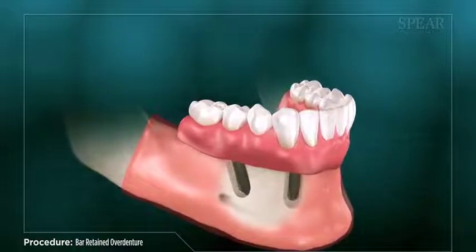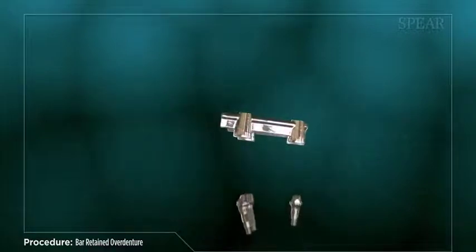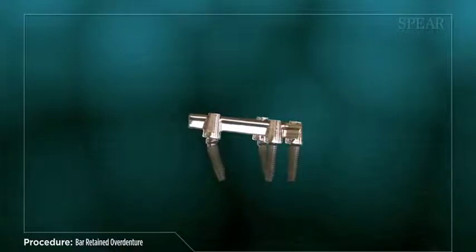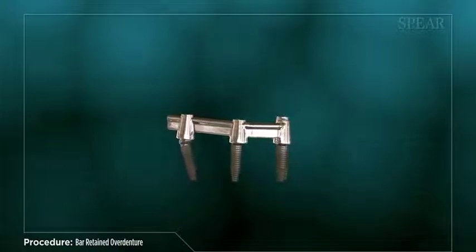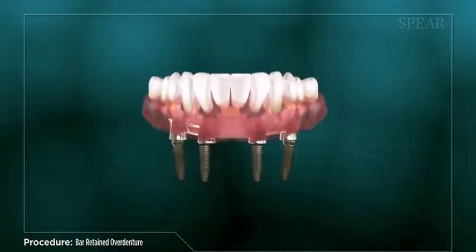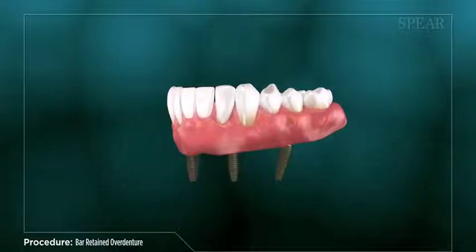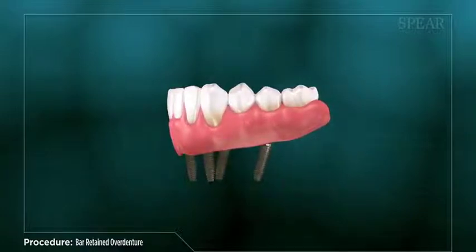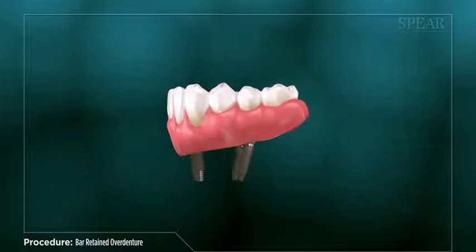It will require multiple appointments for your doctor to place the dental implants and design your overdenture. A bar retained overdenture is a removable prosthesis placed in the mouth containing replacement teeth, mounted in a base made of pink resin, creating an exact fit over your existing gums. It has clips underneath that securely attach to a metal bar fixed in place using dental implants, which are artificial roots placed into the supporting bone. Utilizing implants not only provides a solid foundation for the denture teeth, allowing for optimal eating and speaking, but also helps to prevent the surrounding bone from shrinking over time without a tooth root structure to support it.